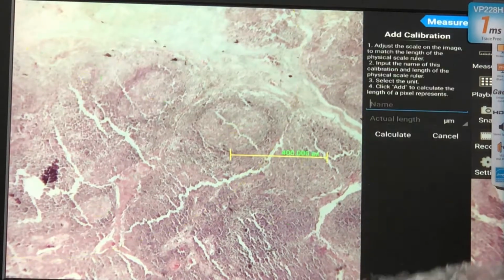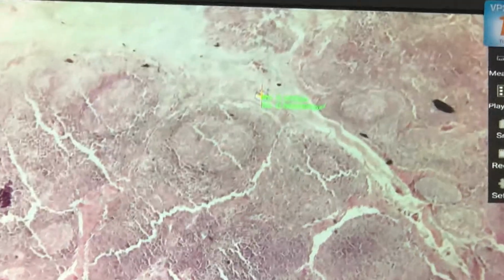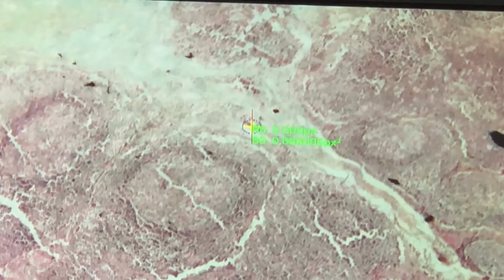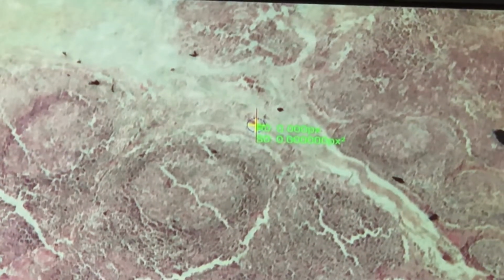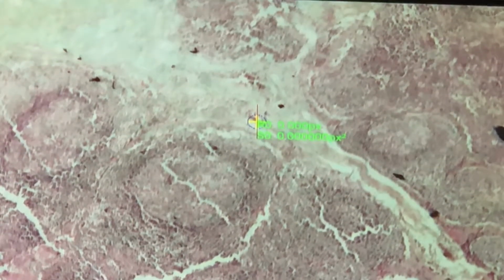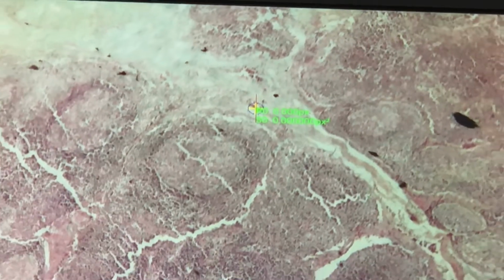When I point the fibrous capsule in pointer number 1, that one, that area that I mark, that is the capsule. So you see at the capsule periphery, there are numerous lymphoid follicles.